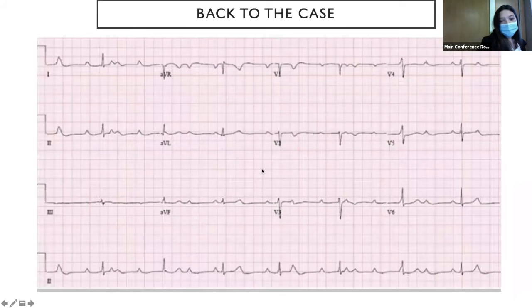Okay. So Harry, let's go back to this EKG. You mentioned the rate. So what would you say the rate is for the ventricles here? It might be hard to see, but this one's on one of the lines. What is it?